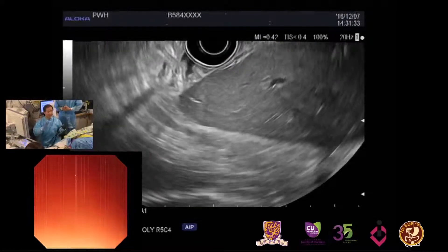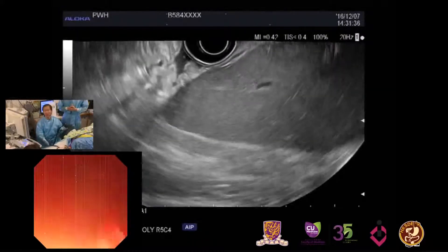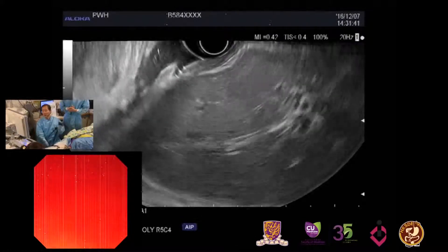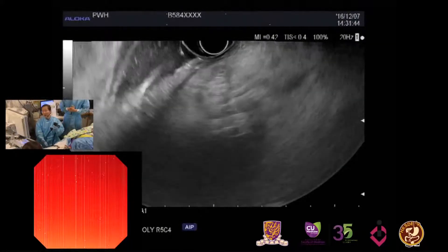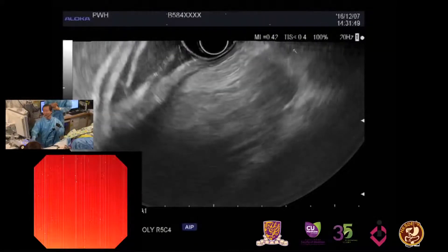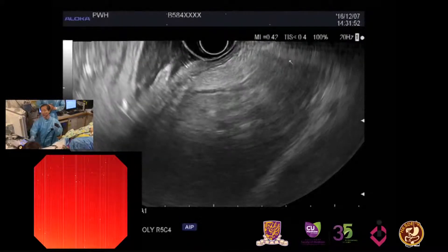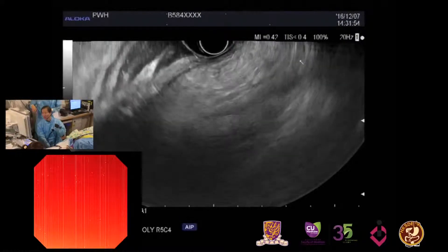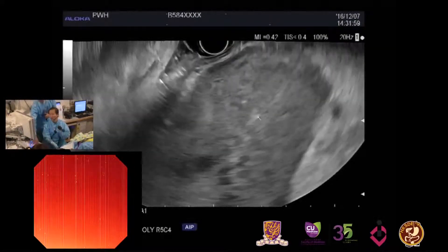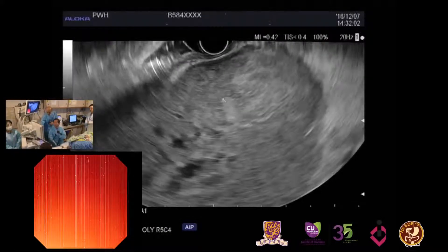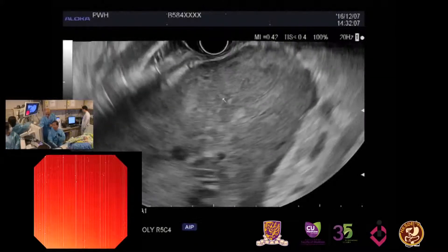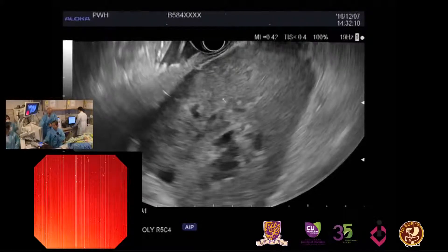Now I am in the mid part of the stomach. We are looking at the liver here — left lobe of the liver. If I rotate posteriorly, I may see some of the pancreatic tissue. I guess this area is quite suspicious for pancreatic tissue. But if I rotate a little bit more, then suddenly this mass comes into view. This is a huge mass. Inside there is some cystic cavity and some blood flow, and the echogenicity is quite heterogeneous.